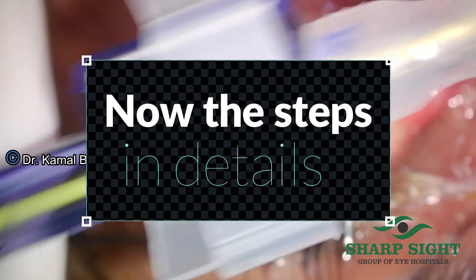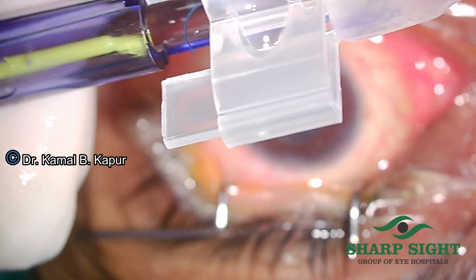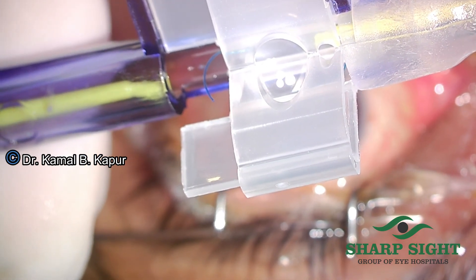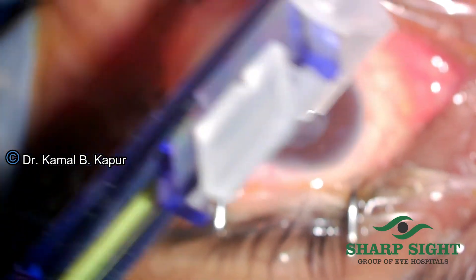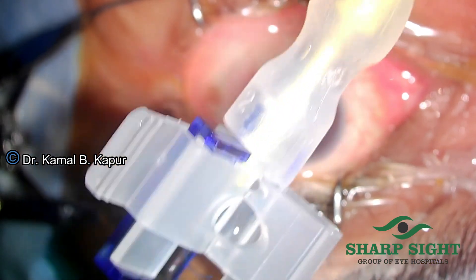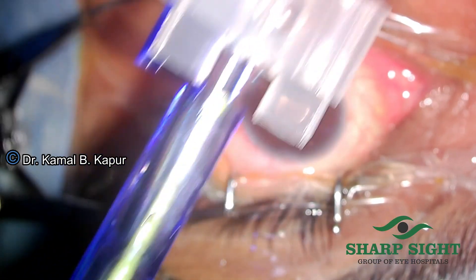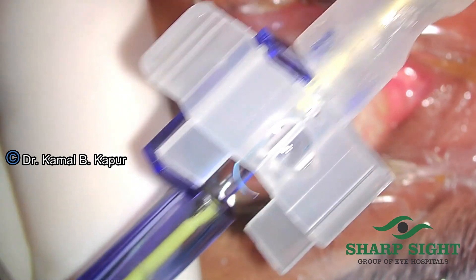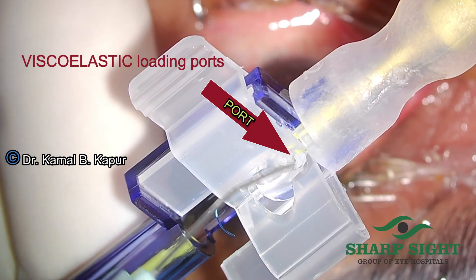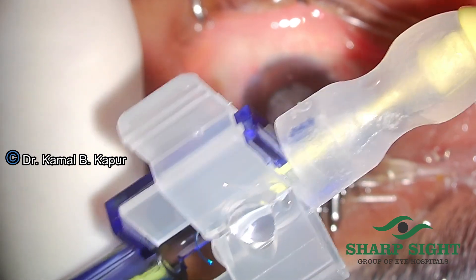Now for the details of loading the cartridge. This cartridge comes with a preloaded lens. There is a port opening where you inject the viscoelastic. Put enough viscoelastic in the port so that it travels into the tunnel of the cartridge. There is a lock available on the preloaded IOL. We have to pinch this lock to remove it and expose the IOL. We then inject some viscoelastic into the given ports gently, without dislodging the haptic or the IOL from its place.